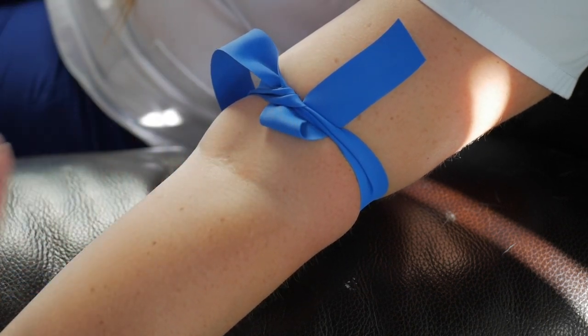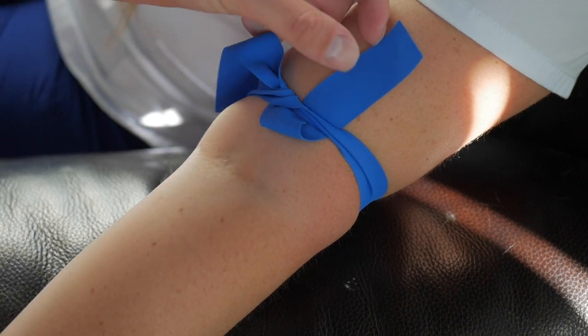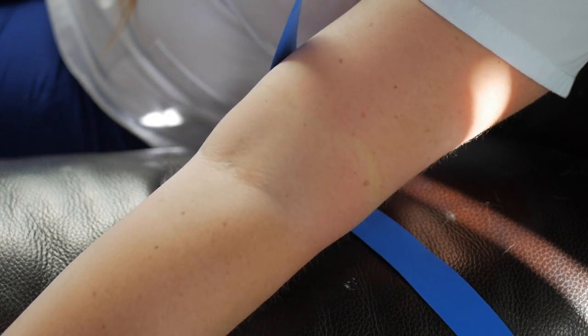Right there is exactly the kind of knot you're going to want because it's a nice quick-release knot. When you're ready, all you have to do is pull on one of the tabs that you tucked under and it will release really easily like that.